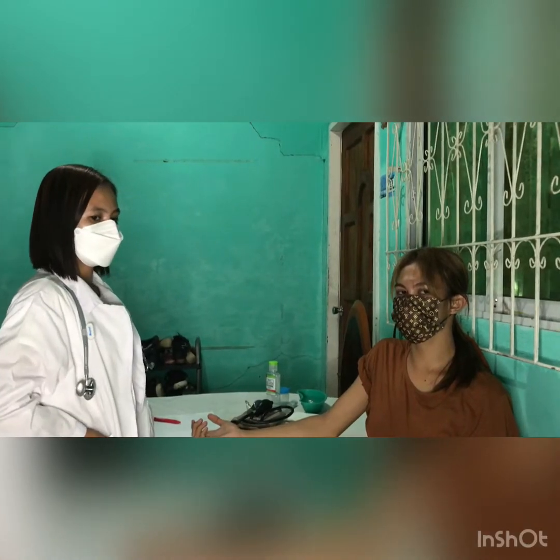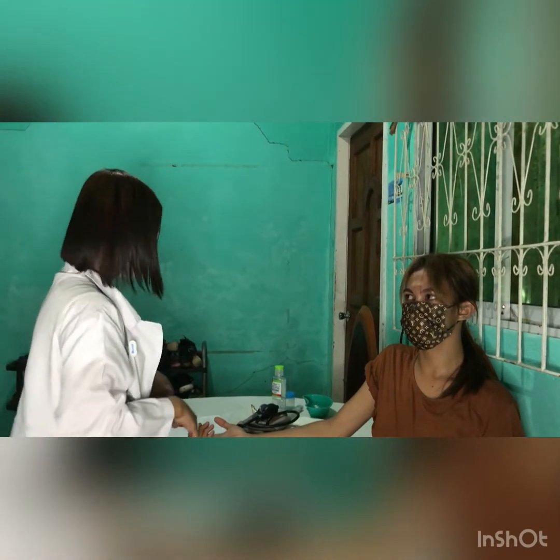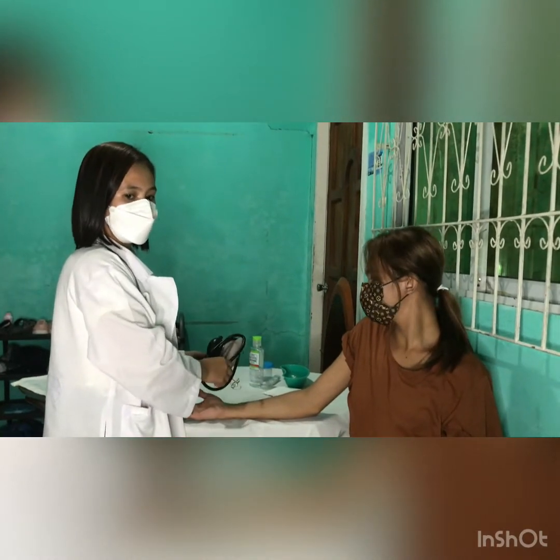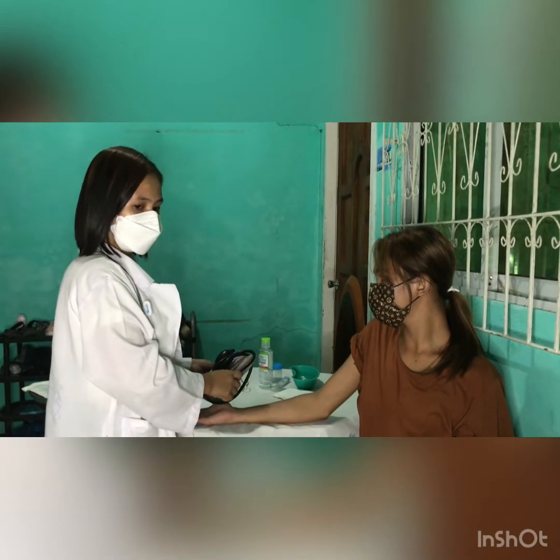And then, ask the client not to speak when BP is being measured. So, ma'am, please do not speak when I start measuring your BP. Smoothly and evenly apply the cuff with its lower border located about 2.5 cm above the antecubital space.